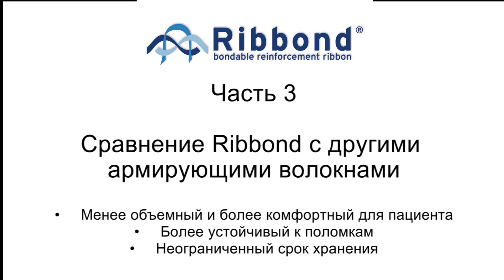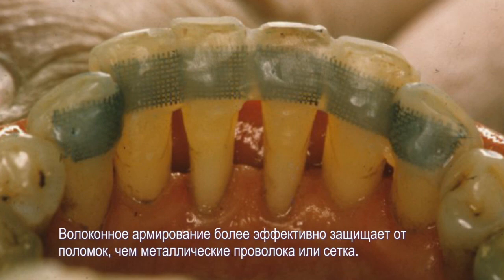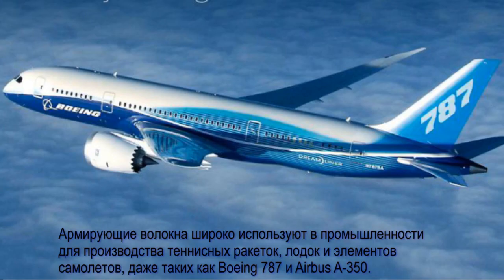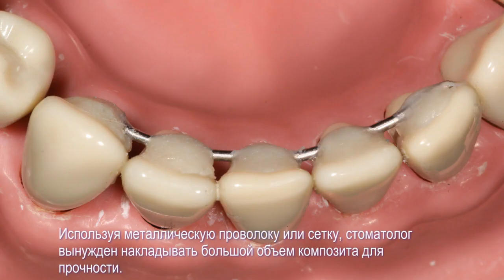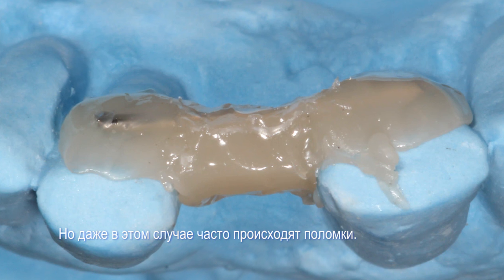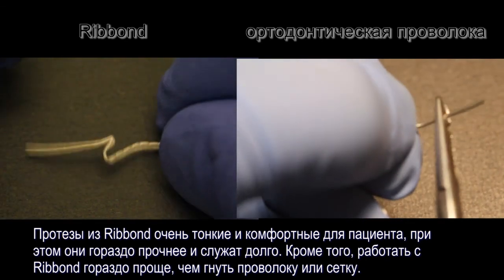How is Ribbon different than using a metal wire or mesh? Fiber reinforcements are far more effective at preventing fracture failures than metal wires or meshes. Fibers are used to reinforce industrial resins to make tennis rackets, boat hulls, and airplane body components such as the Boeing 787 and the Airbus A350. Metal meshes and metal wires are not used for these industrial applications as they are not effective reinforcements. When using metal wire or meshes, the dentist relies on a large bulk of composite resin to provide strength, and the mode of failure is still fracture failure. A Ribbon prosthesis is very thin and comfortable for the patient and much more fracture tough, resulting in much greater clinical longevity. Furthermore, Ribbon is much easier to use than trying to bend a metal mesh or wire.